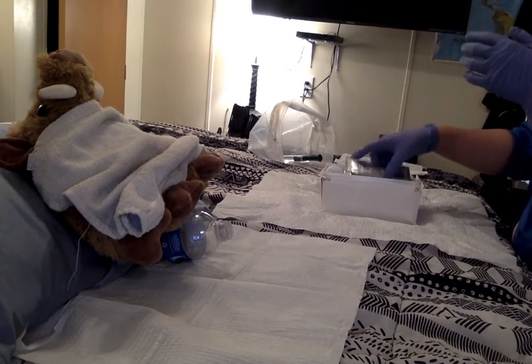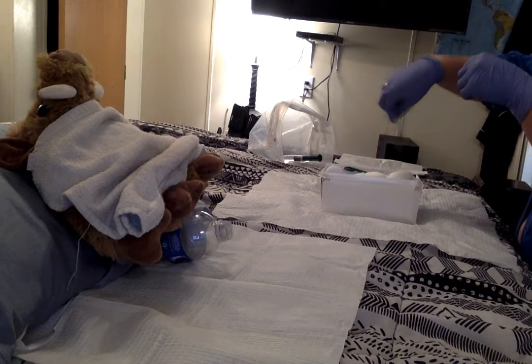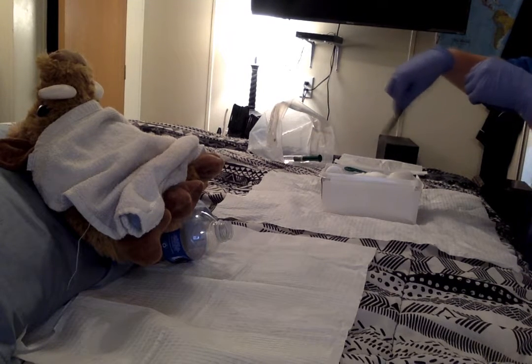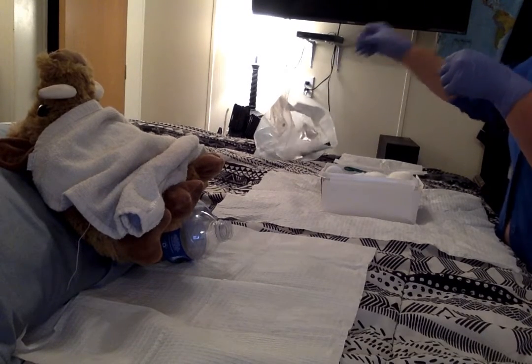Next thing we're going to do is we're going to grab our iodine. We are going to put that all over our cotton balls, make sure that our cotton balls are nice and soaked, and we're going to throw this in the trash. This thing did not want to stay up.